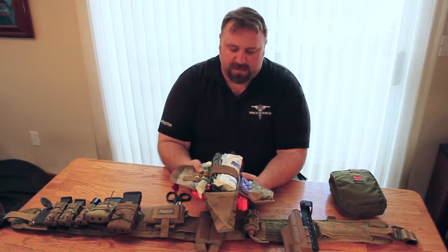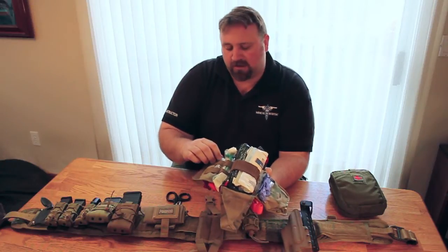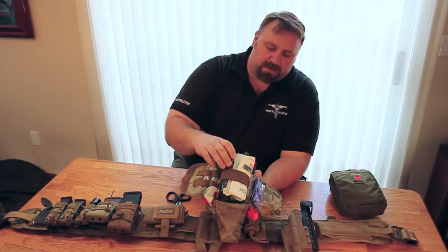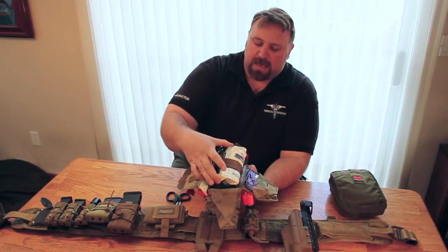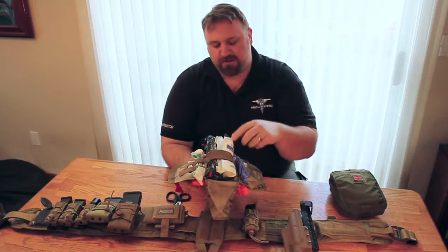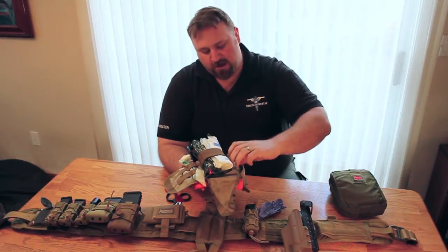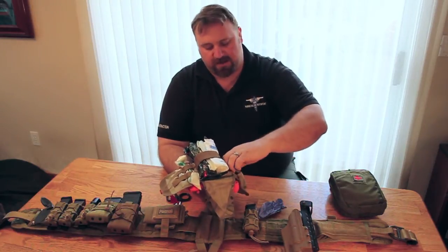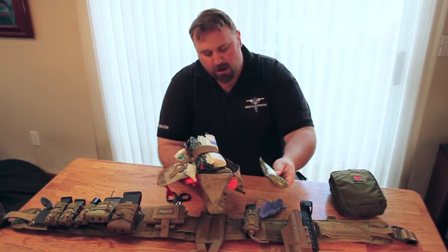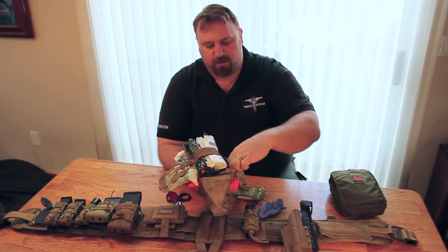In this one you can see we have two tourniquets on the outside. I store an NPA with lube — never forget the lube. Also a regular elastic trauma dressing, a 12-gauge needle for decompression, and some regular gauze. In the pouch I always keep extra gloves, because no matter what I'm doing I want to go home at the end of the day to my family and not have something get me months or years later. Also some QuikClot and a small fold-out CPR mask.